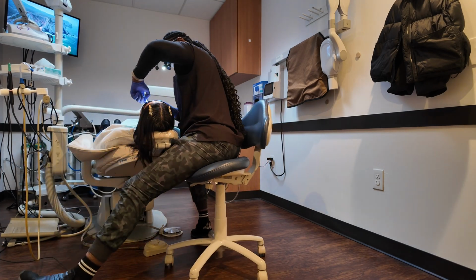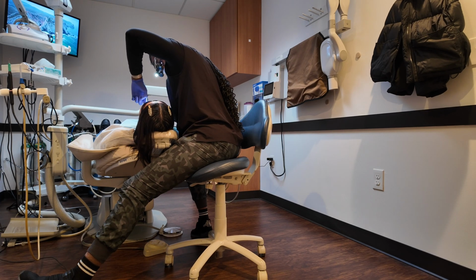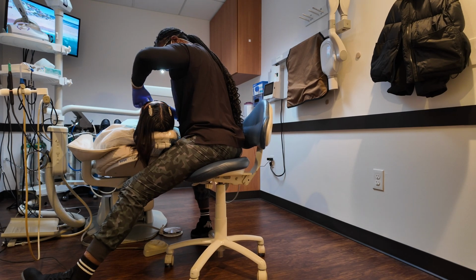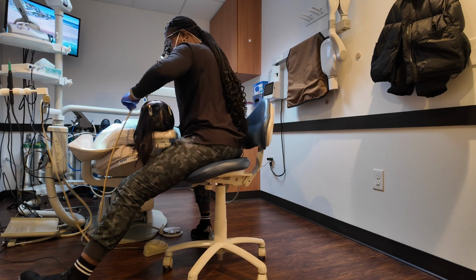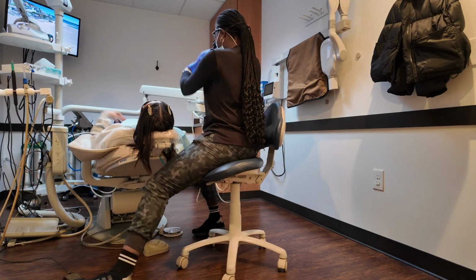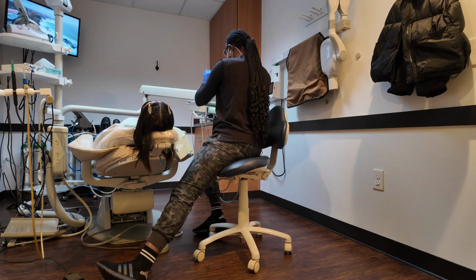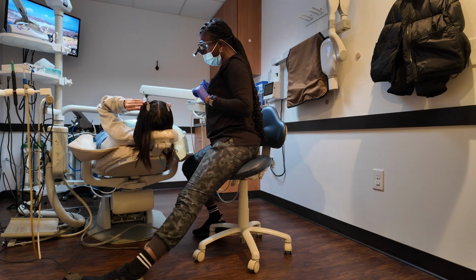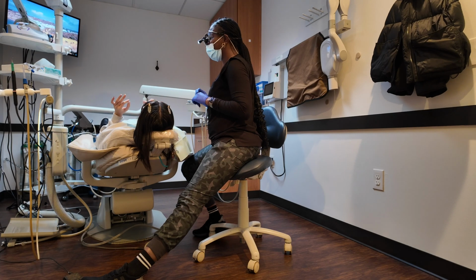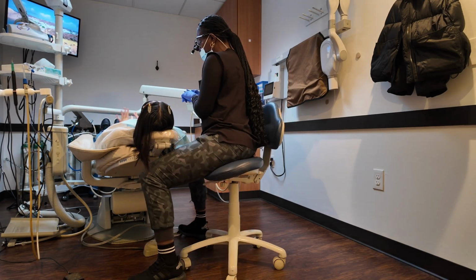So whenever I have patients that come in and they have a lingual bar, or we call them lingual retainers, those are the ones that are kind of glued in or bonded into the teeth. They're on the inside row. I like to start off flossing those first because it does take a little bit more time. It's a little bit more tedious. And so that's why you are seeing me grab a long piece of floss secondary. But I start off first with the retainers if they have any, or bridges if they have any. And then I go in with the regular string floss and do the rest of the mouth.